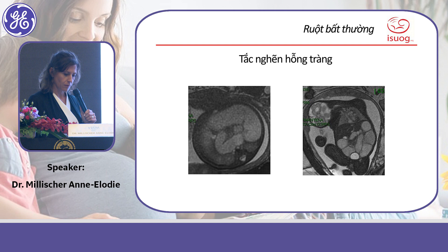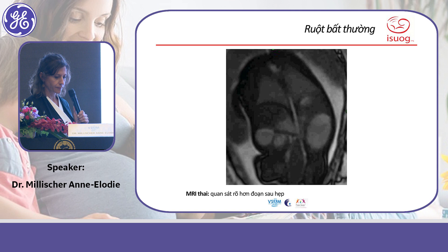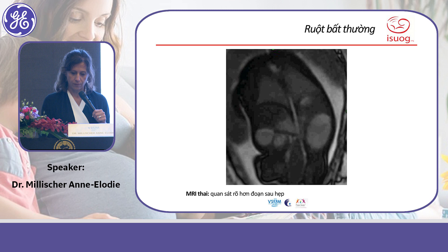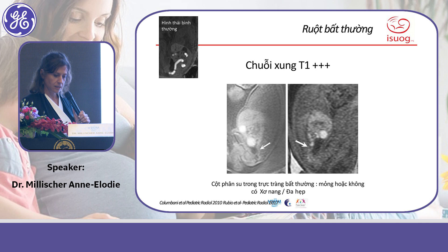Here is an example of a jejunal occlusion where you can see a markedly dilated bowel. On MRI the dilated bowel loops are very large. With cine MRI, it is easier to see the remaining bowel — the downstream post-stenosis segment just after the occlusion.